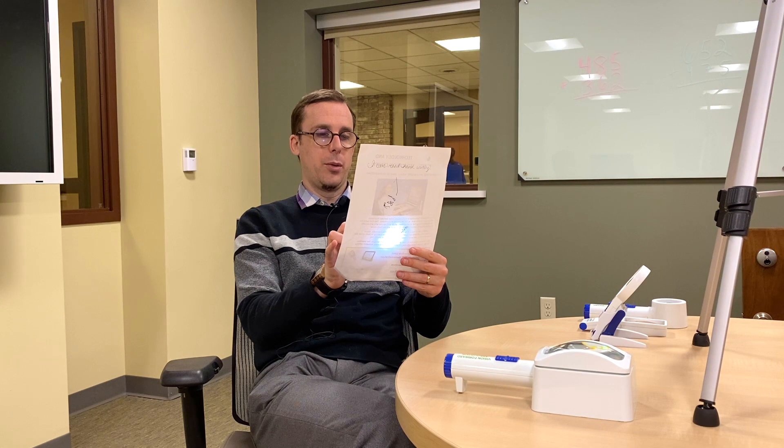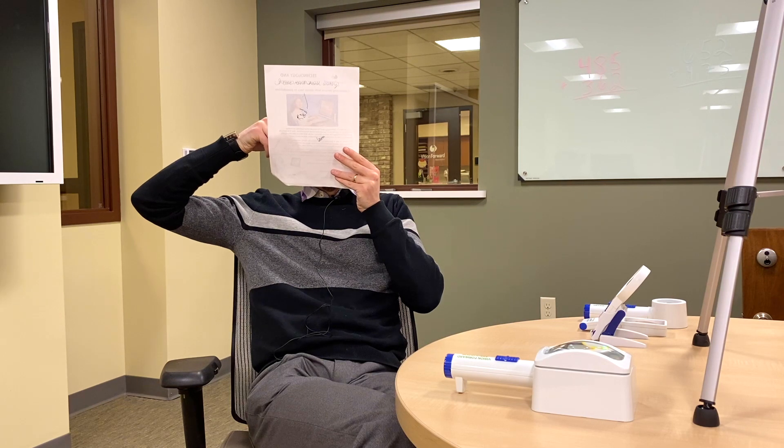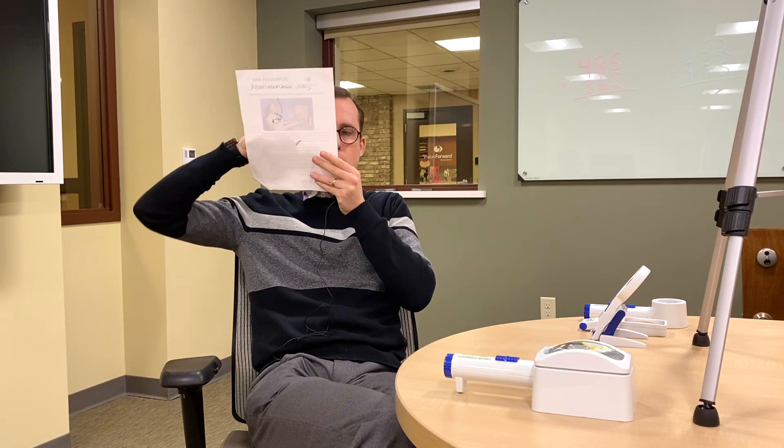One good idea when using a magnifier is to optimize the field of view. With higher powered magnifiers, the lenses are smaller, so if we hold the magnifier over the page, we might only see one word at a time. One thing we can do to get around this is hold the magnifier up to our eye instead, then hold the reading material up until it's in focus. That way I can see about three words at a time instead of just one — a wider field of view. It can get a bit tiring, but if you have the strength to do it, it's a good way to use a magnifier.